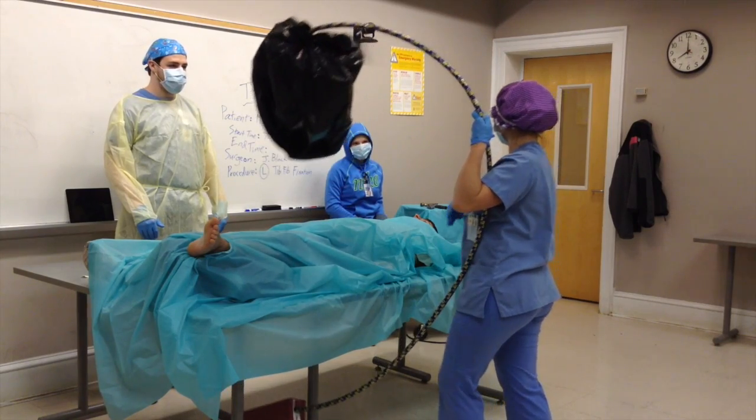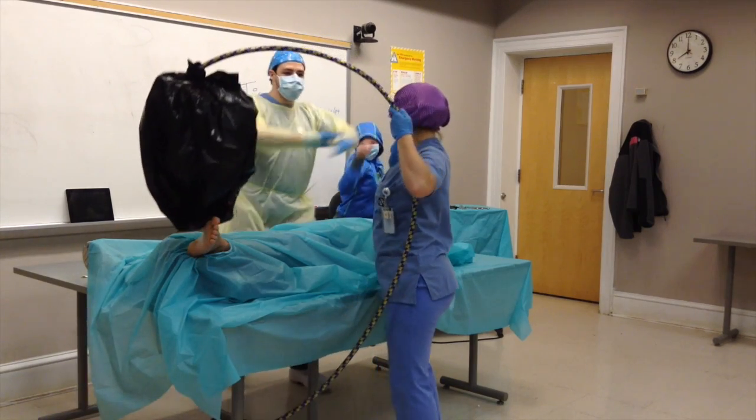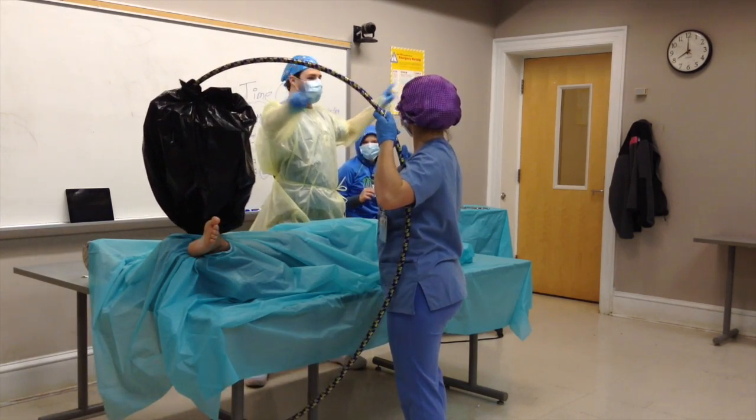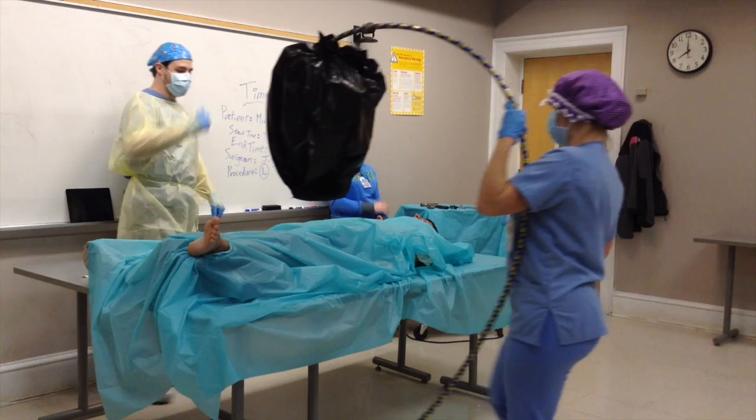Standard etiquette and practices must be followed in the OR to keep the sterile field maintained. One should never reach over the blue draping unless he or she is sterile, as it will contaminate the field. Always make sure the area of interest is covered with sterile drapes before carefully placing the C-arm.